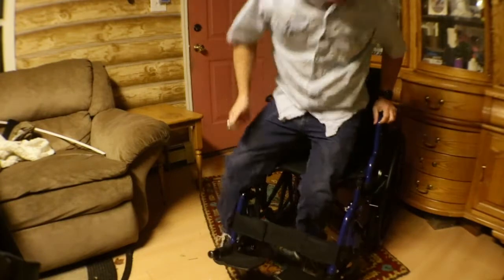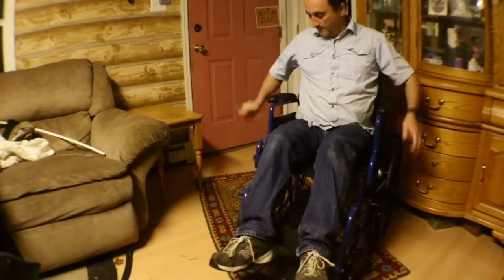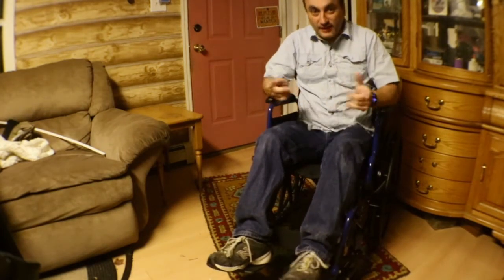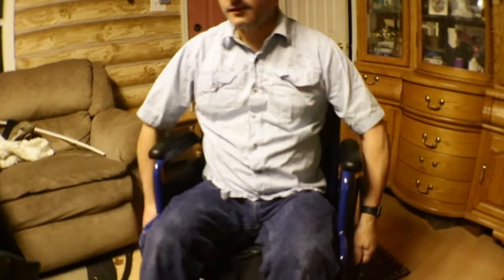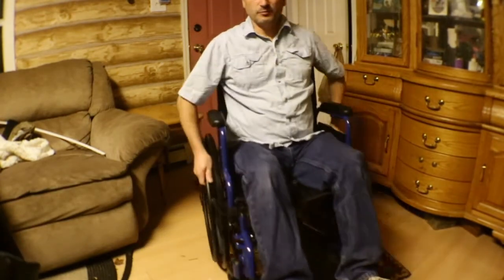Now let's sit in and try it out. It's good for short-legged people, and we're very short-legged — anyone that knows me knows that, and so does my mom, so that's definitely a bonus. It works great and it's actually pretty comfortable.